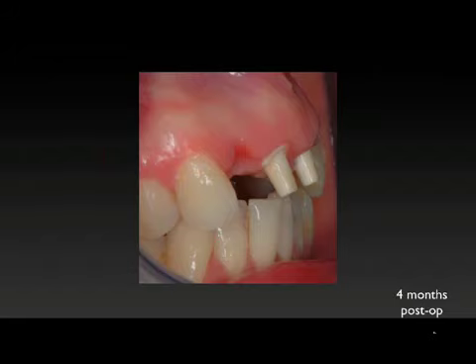If you had further resorption that was more palatal and you needed cantilevered pontics, cantilevering facially, you would have to have screw holes. You could do all these things with titanium, but you're doing it as a compromise to having an ideal bridge. With these implants, you need to have an ideal foundation before moving forward with reconstruction. But if we think about it, this is where we want to be with titanium. We don't want to compromise.